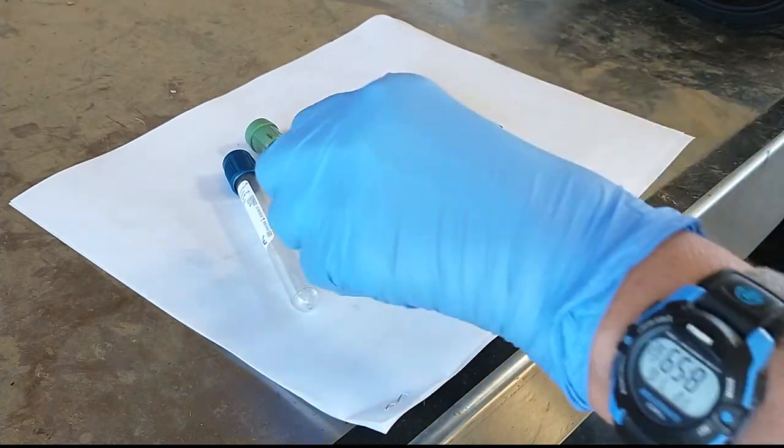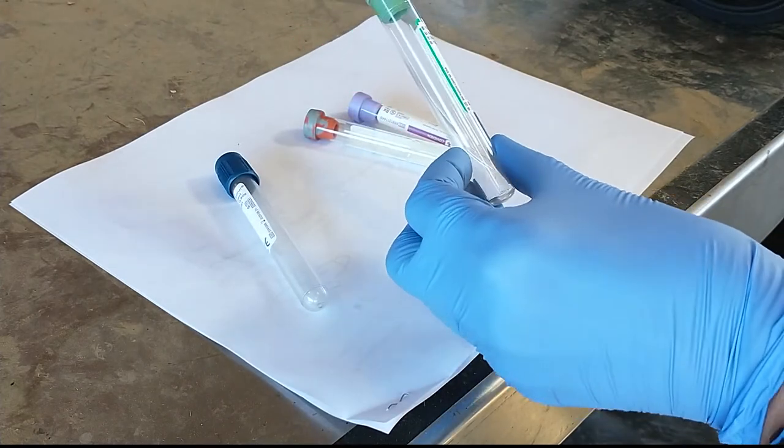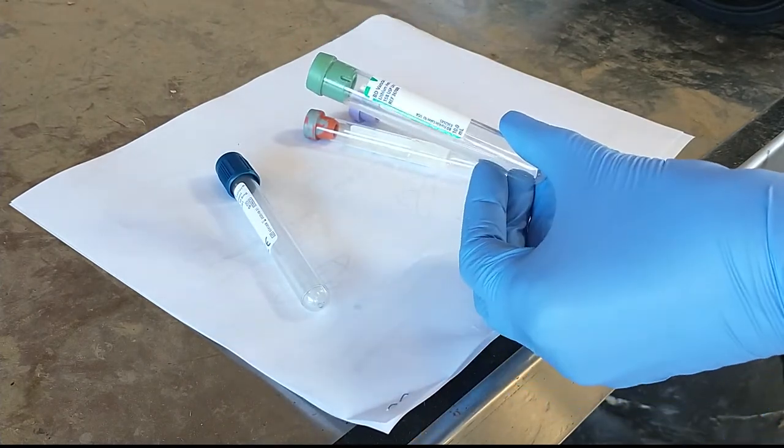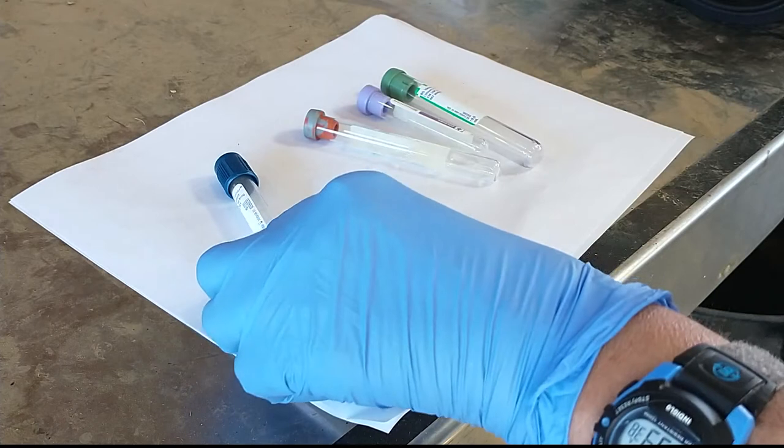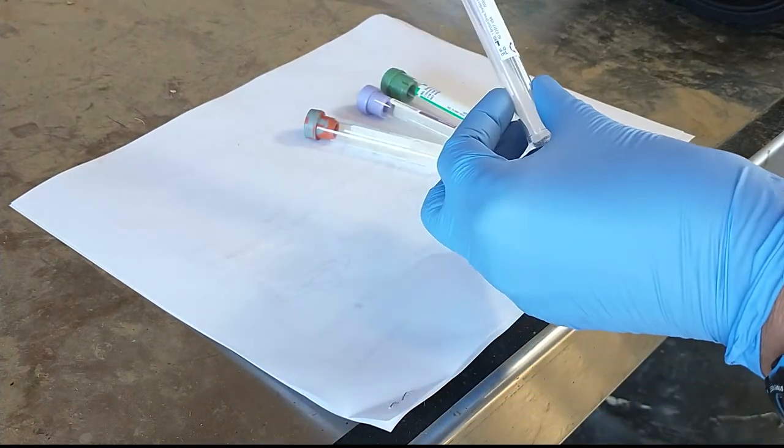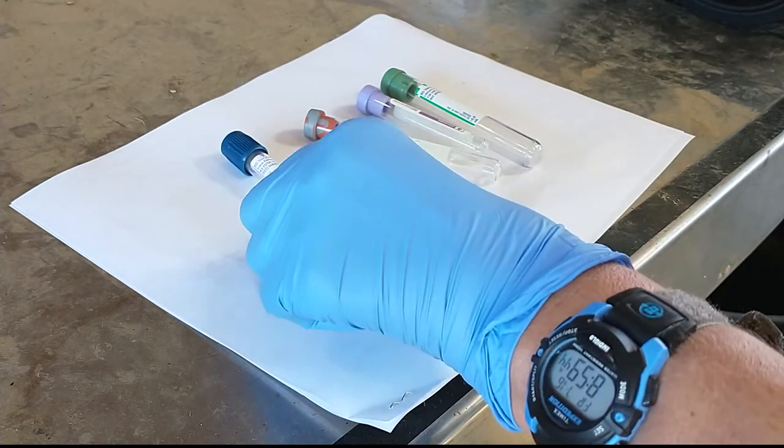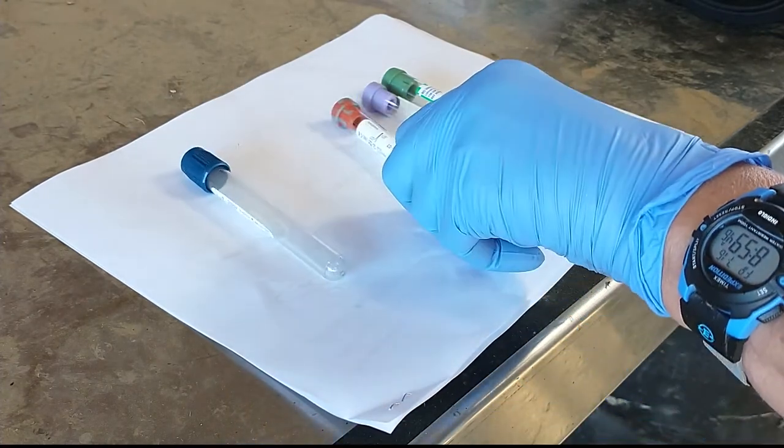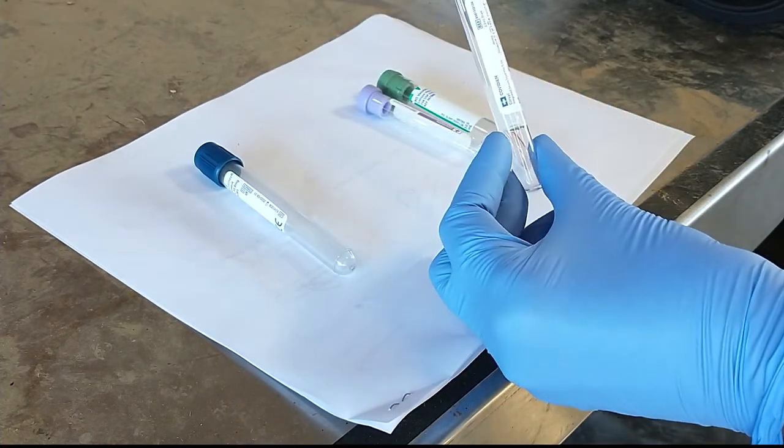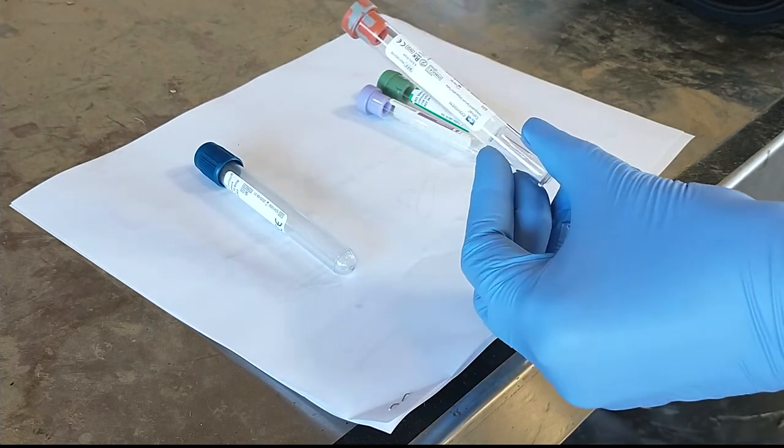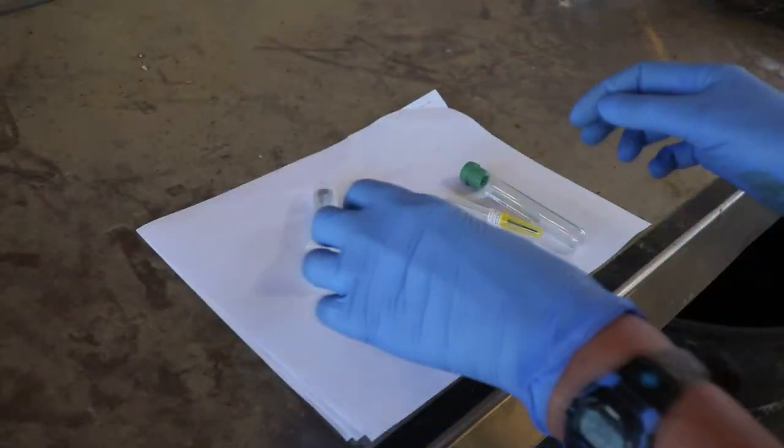The color of the stopper tells you what type of additive is in the tube. For example, green top tubes have the anticoagulant heparin added, purple top tubes have EDTA added, royal blue top tubes have zinc free caps which is important when submitting blood for trace mineral panel, while red top tubes or tiger top tubes like this one have no additives and are used when serum is needed.